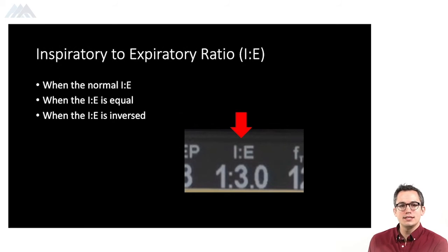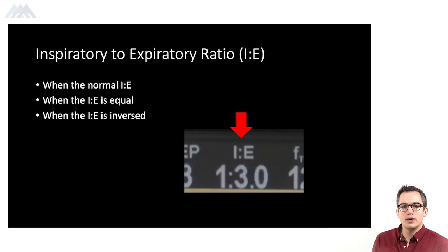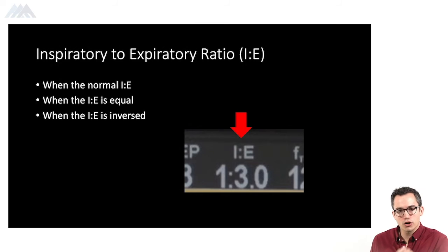But for different reasons, if patients were having difficulty oxygenating and you increase their inspiratory time for that breath, you're going to bring that ratio of inspiration to expiration closer together. So what that's going to do is you're going to inspire, hold that breath in longer, allowing for more oxygen to diffuse across those alveolar units before you're exhaling.